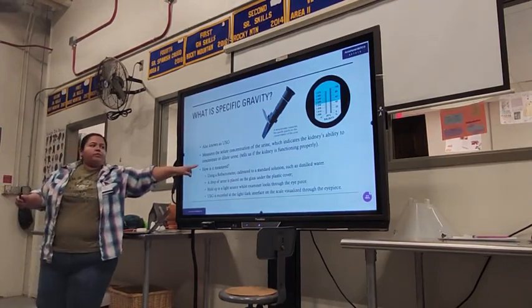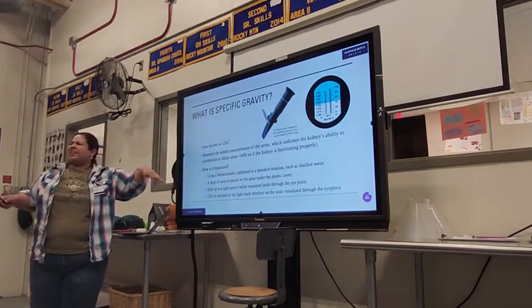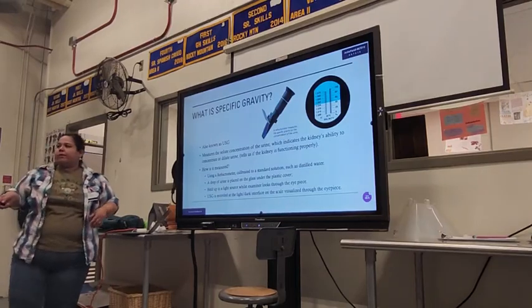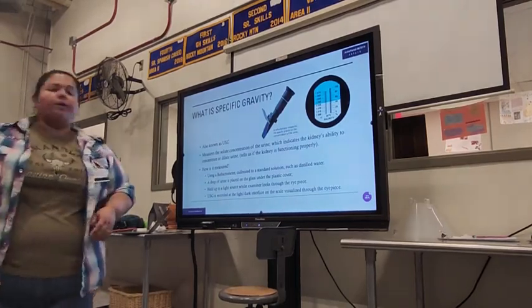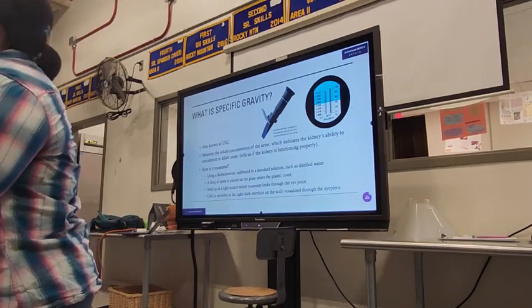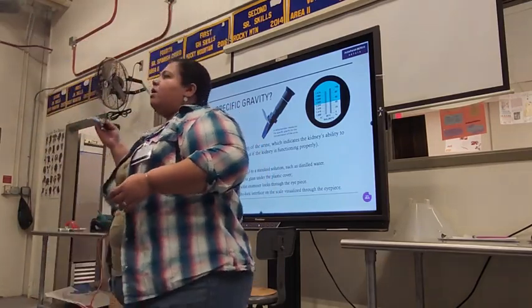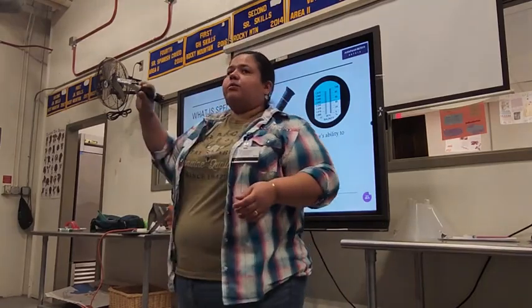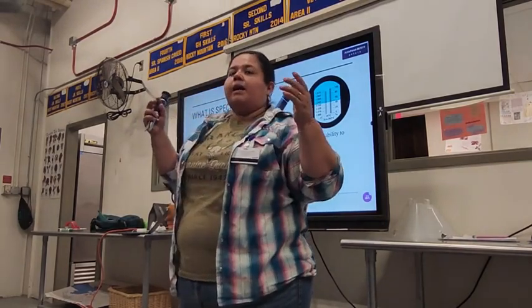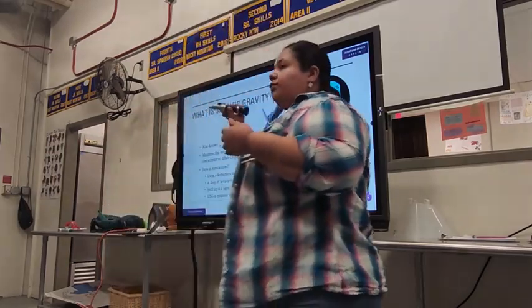If it's too dark, if it's too concentrated, something's wrong. If it's too clear, too diluted, something's wrong, right? It needs to be within that sweet spot. Now, how is it measured? We use a refractometer, okay? We use a refractometer, and it's calibrated. People will tell you, oh, it's calibrated per species. No, it's not. It's calibrated per solution, by distilled water, because distilled water has been filtered and filtered and filtered, and there aren't any particles left in it, so it'll give us a true value of 0.